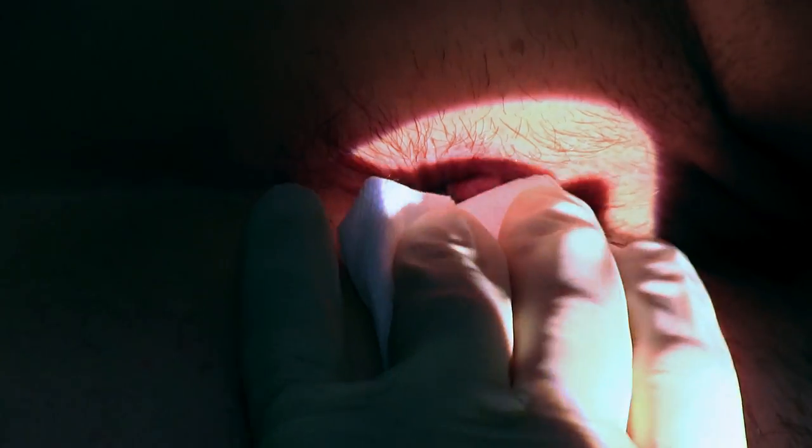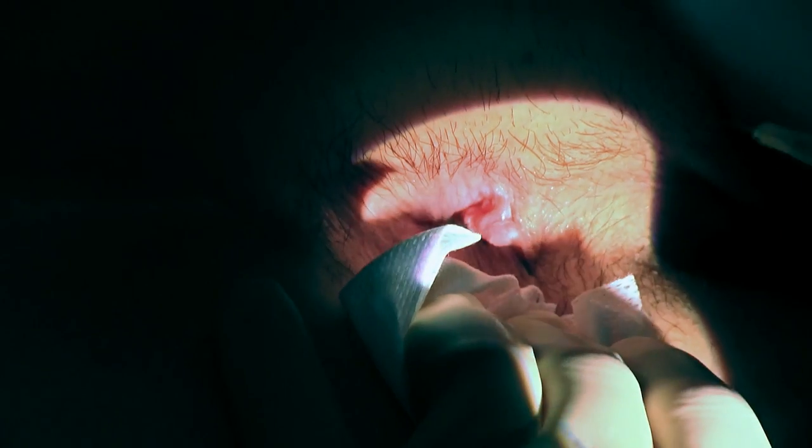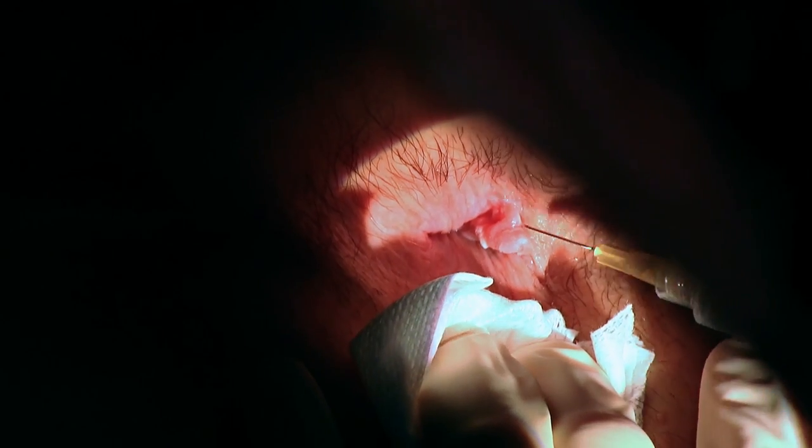Yes — okay, that's because the skin is broken. The next thing we're going to do is put some local anesthetic: lignocaine 2% with 1 in 200,000 adrenaline. We'll use the tiniest needle in the department, but it will nip a little as the needle goes under the skin. The skin around the perianal area is really quite sensitive, so this is going to nip a little with the needle and subsequently with the injection going underneath. It will be over very quickly and then you get full anesthesia.